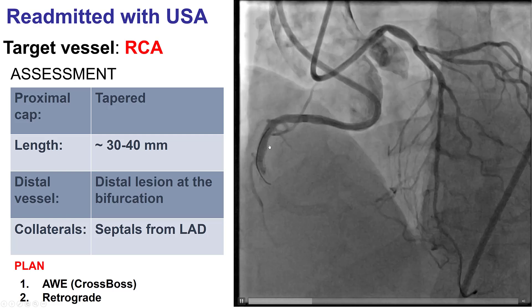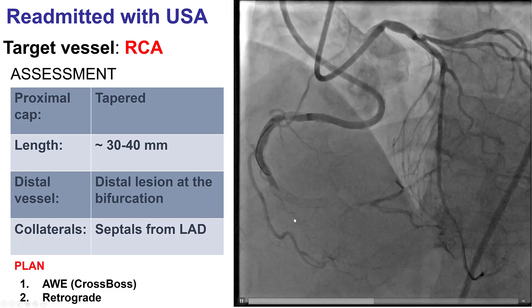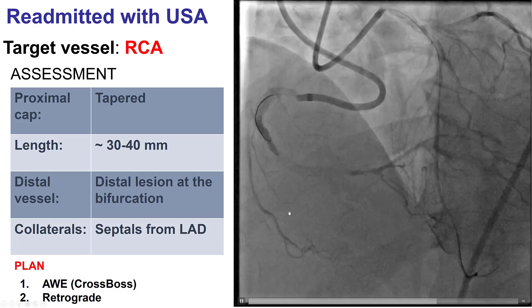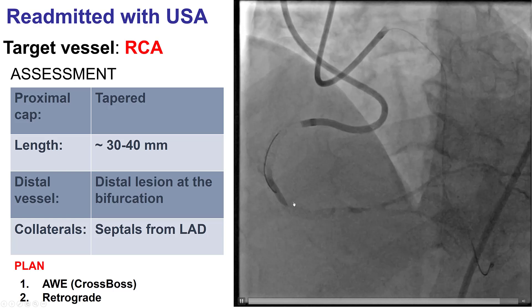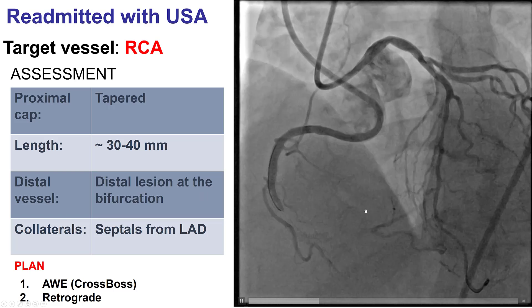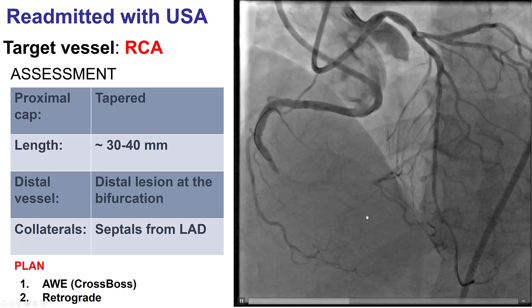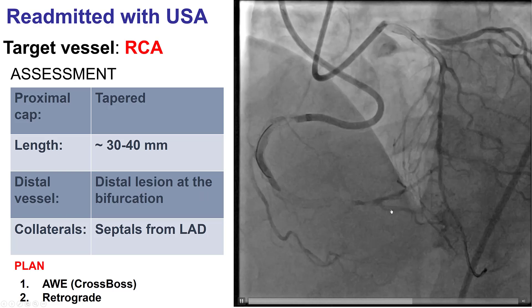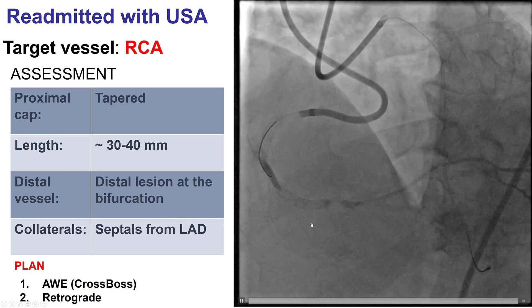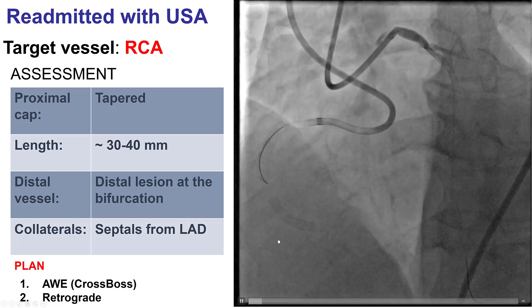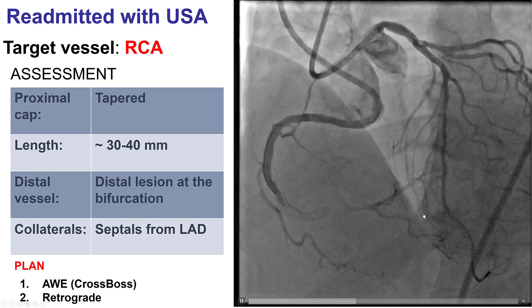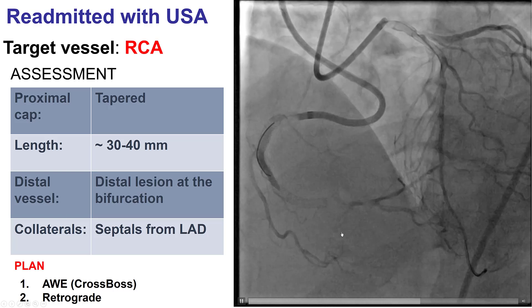What we have here is an in-stent CTO of the distal RCA. There is tapered entry into the CTO. There is a bifurcation close to the distal cap, although there is some calcification there. The length was approximately 30 to 40 millimeters, and there were septal collaterals from the LAD filling the right posterior descending artery.